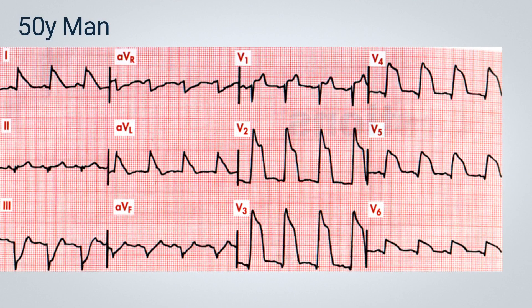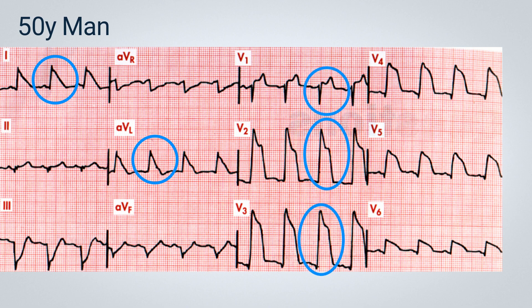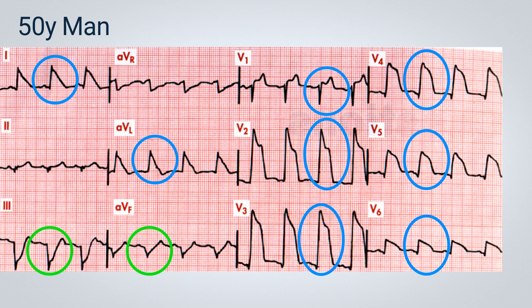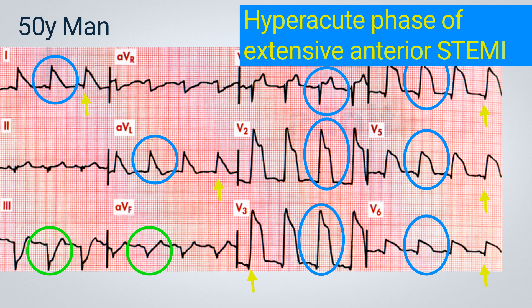The second electrocardiogram features a 50-year-old male patient. I suggest pausing the video to carefully analyze the ECG before I begin discussing it in detail. What immediately stands out in this ECG is the significant ST segment elevation in the lateral leads D1 and AVL, as well as throughout the anterior leads from V1 to V6. In addition, we can see ST segment depression in the inferior leads, particularly D3 and AVF. Alongside this, we can observe the early stages of a Q wave, which becomes more visible in leads V4 to V6. These findings lead us to diagnose the hyperacute phase of an extensive anterior acute myocardial infarction. We can clearly see that the Q wave indicative of areas of necrosis is beginning to form, accompanied by extremely elevated ST segments and a mirrored image in the inferior wall.